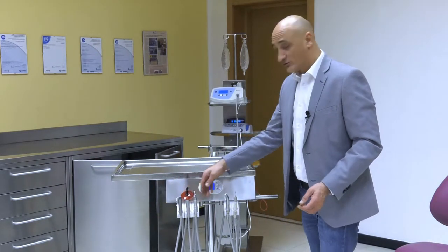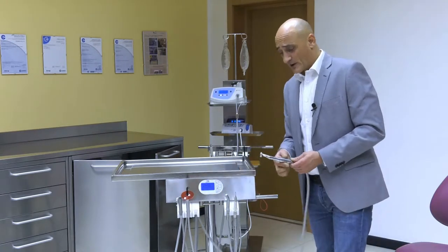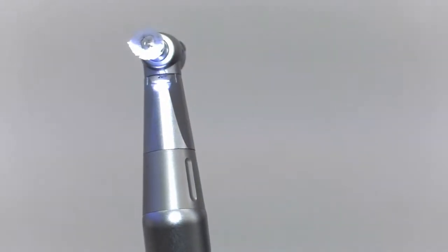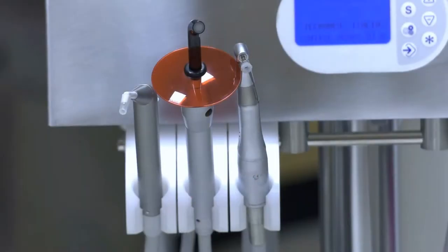As far as dynamic tools go, let us consider the micromotor first. Albeit a new technology fitted with LED lights and an induction motor, the micromotor is not just another dental implant motor. Let us see how it is used.